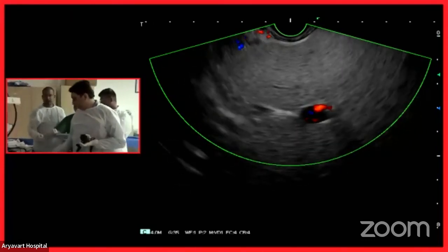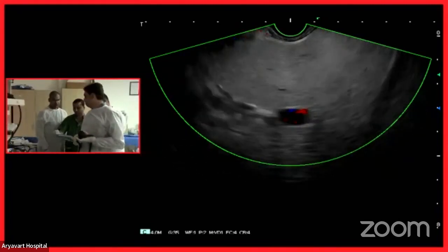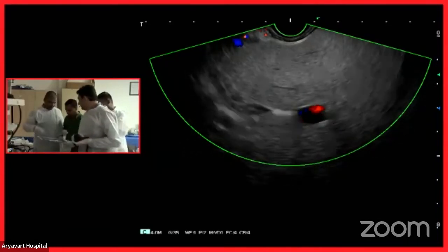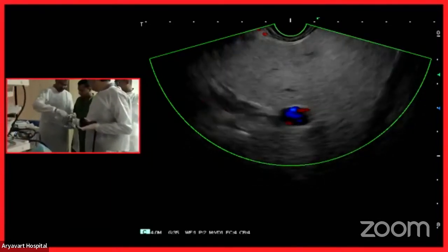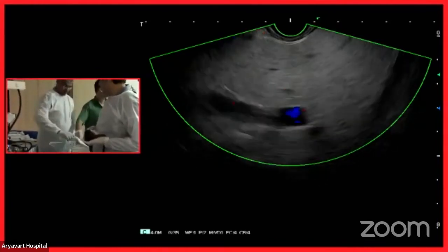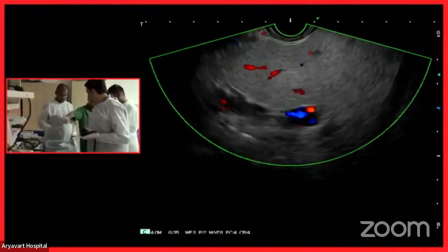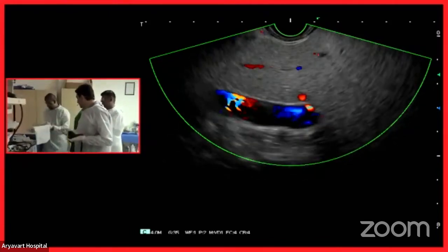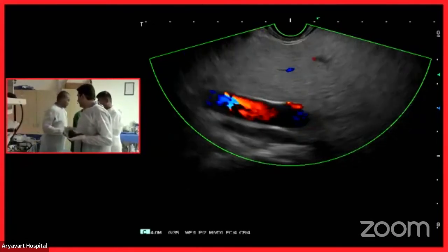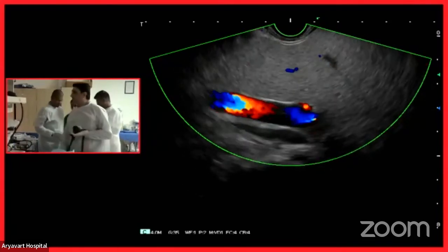So what technique are you going to use? Dry heparin, wet heparin suction, or conventional suction, and how many passes and how many actuations? The data say people use the wet heparin technique, but we use the conventional one, where we don't use anything. First, go with the stylet, then see how many passes you make, and see the core. If the core is good, I think one is enough.